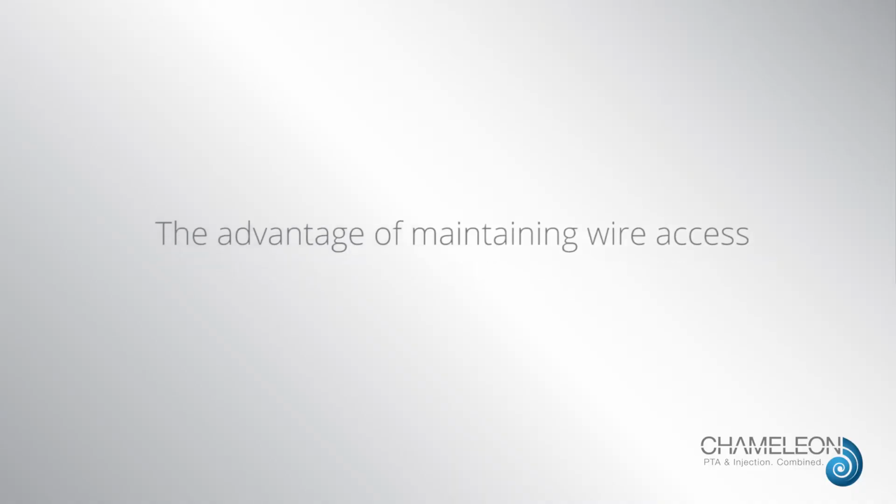And then lastly, one can look at the arterial anastomosis and that juxta-anastomotic area to make sure there's no stenoses there, any residual clot that needs to be fully swept. I find this to be a great advantage.